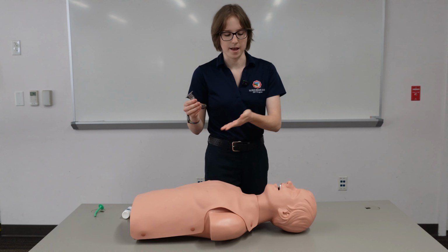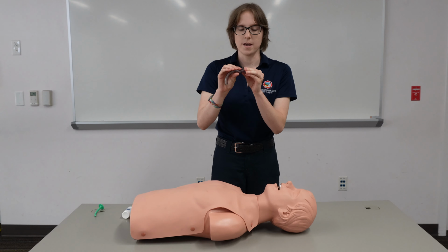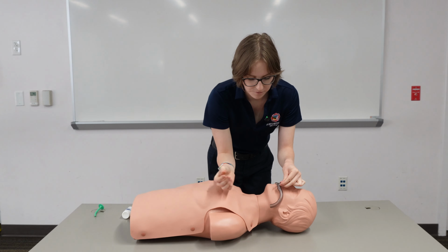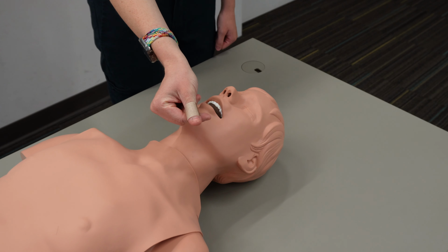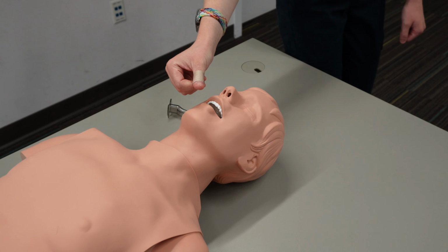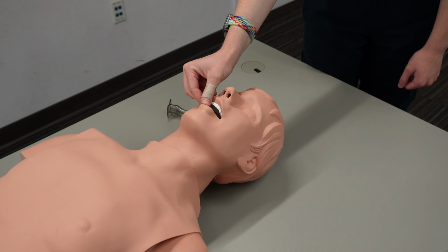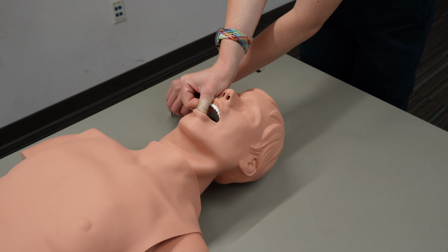Now I'm going to go ahead and apply the device. So I'm going to start by measuring my OPA, measuring it from the patient's front teeth to the angle of the jaw. So then I'm going to take my cross finger technique, crossing my thumb and pointer finger like so. I'm going to place my thumb on my patient's bottom teeth, my pointer finger on my patient's top teeth, and then I'm going to apply pressure in opposite directions to open my patient's mouth.